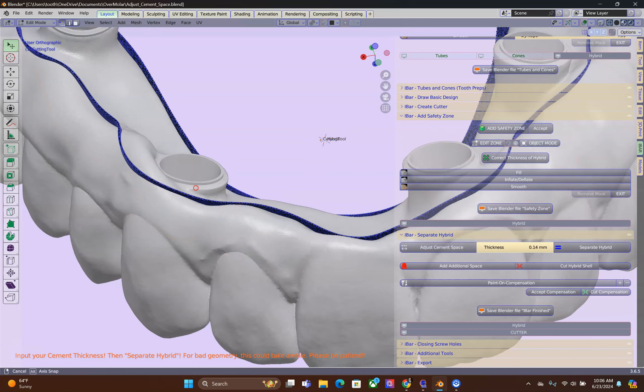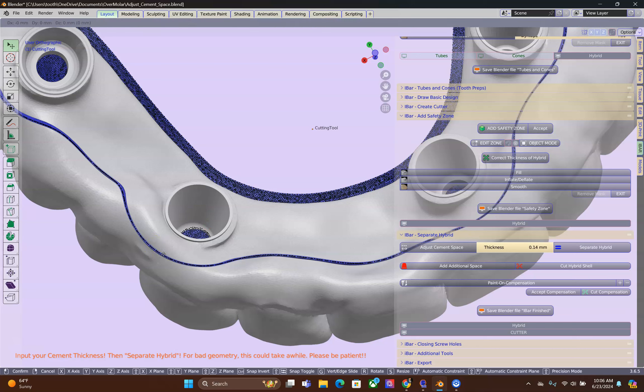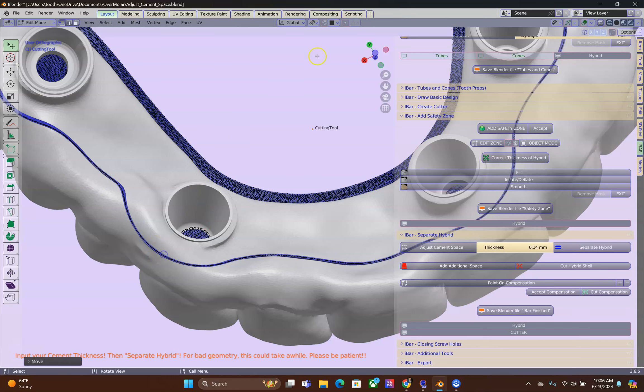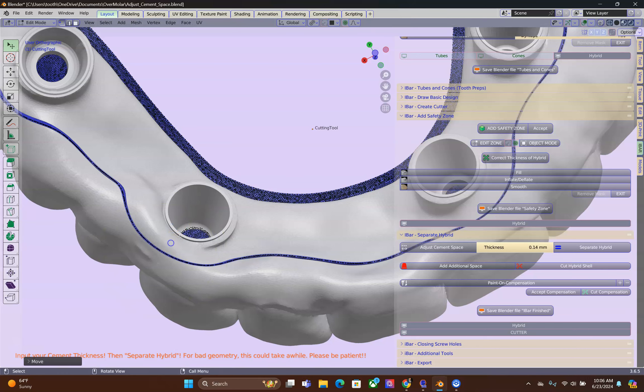Select it, Tab to edit. Make sure the proportional editing is on and then use the G key. However, where there is a screw hole, you have got to exercise caution.